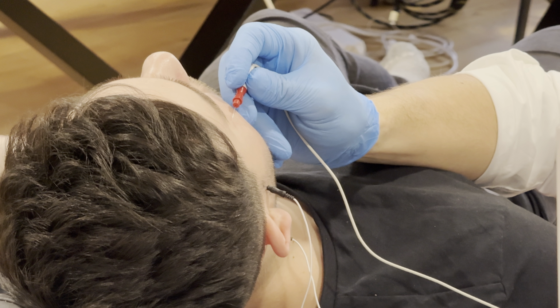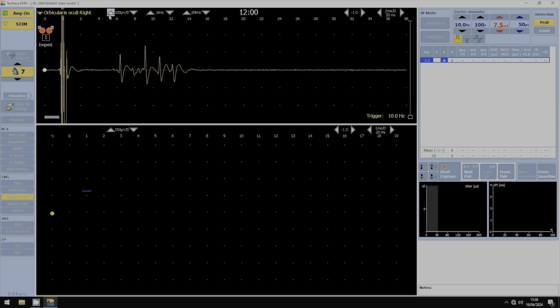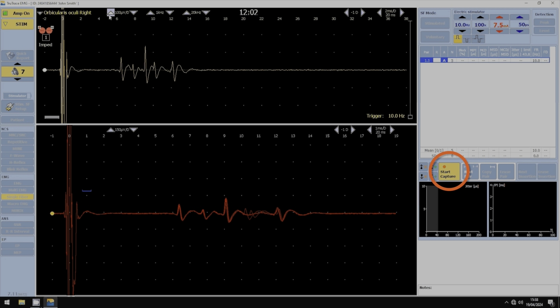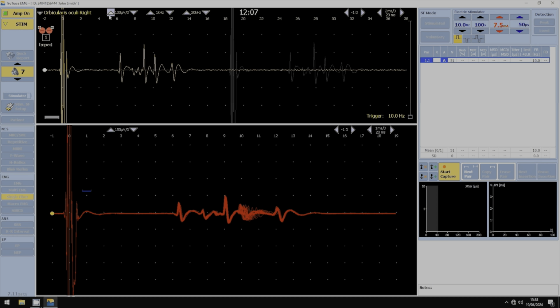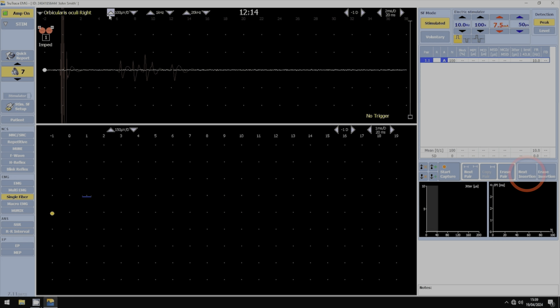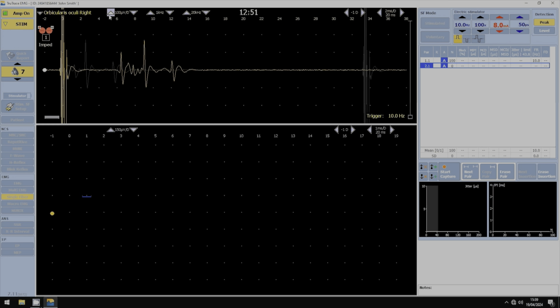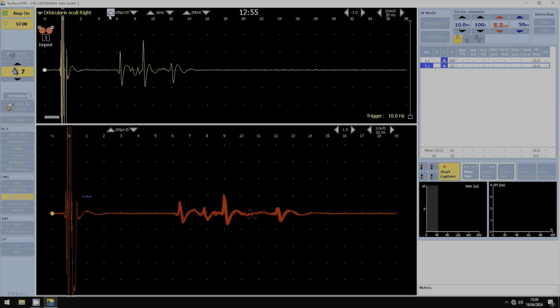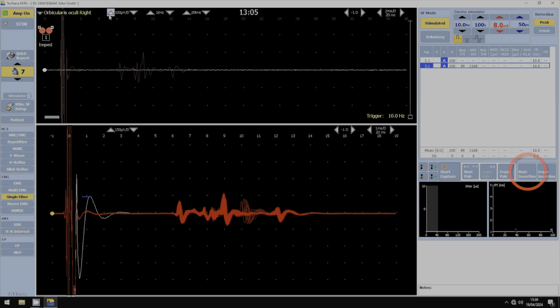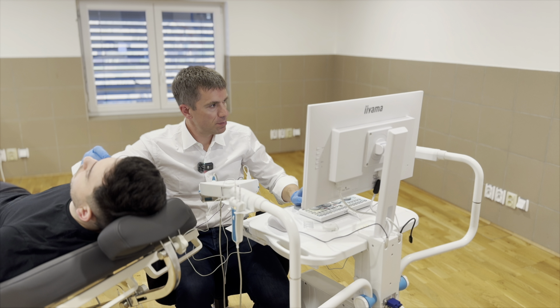Whenever I see a stable pair, I will press with my pedal. I will start the recording. At least 100 recordings. Now I go to the next insertion, and we will repeat the same procedure. Now in the beginning we have 2 stable fibers, which I will record. I will go to my next insertion and start again the stimulation.